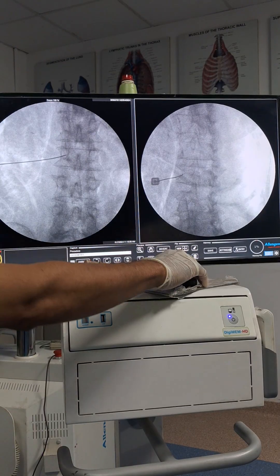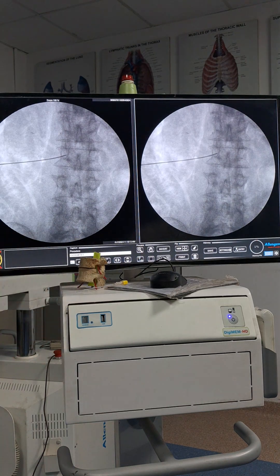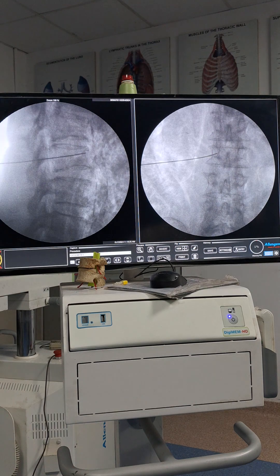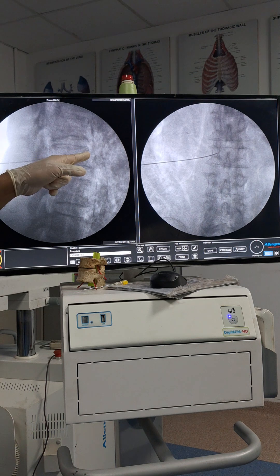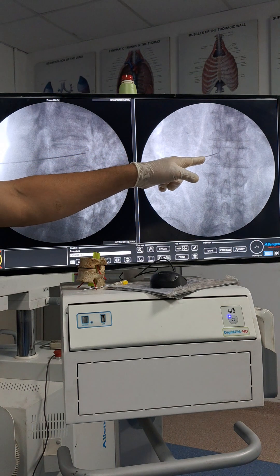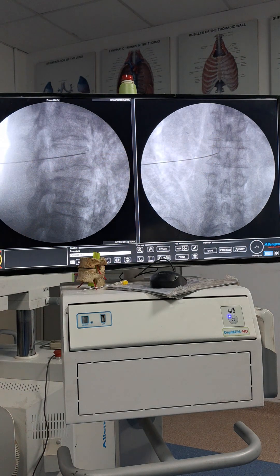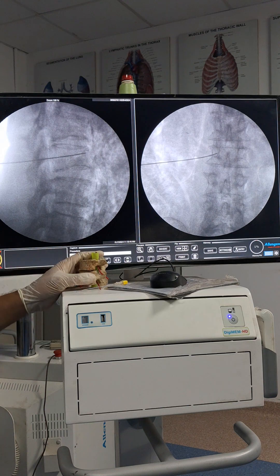Let us see the AP view and lateral view together. In lateral view: the needle is at the anterior border of the vertebral body. In AP view: the needle is at the facet line. This should be the final position for lumbar sympathetic block. Thank you.